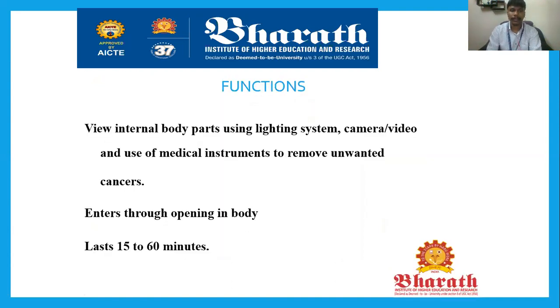Functions: to view the internal part using the lighting system, camera, and video, and use it as a medical instrument to remove unwanted cancer. Endoscopy is not only used as an imaging instrument, it is also used as a medical instrument to remove unwanted or infected parts from the human body without any surgery.